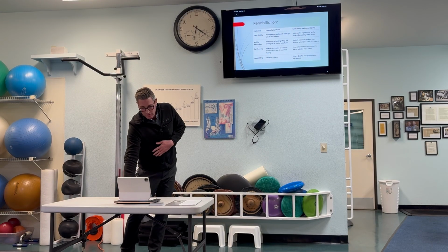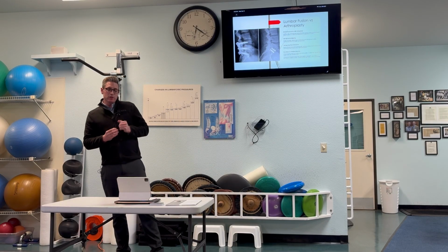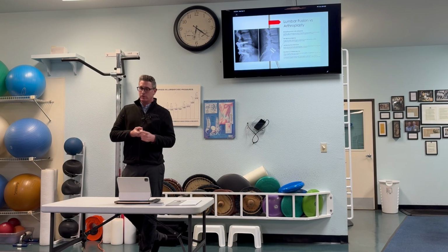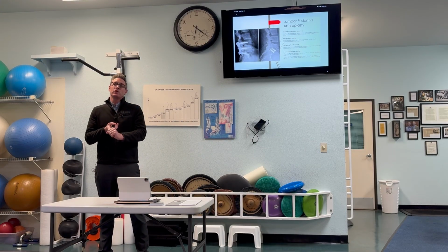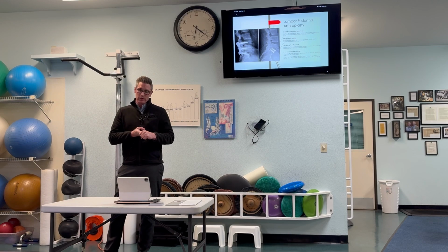This is pretty similar. I also asked AI just to see what they thought with this. Overall, about the same and similar answers. So I think when we're comparing these two, the biggest point is the motion of the spine. A lumbar disc arthroplasty has preservation of motion, whereas a spinal fusion is stabilizing, or removes the motion from the segments that are fused.